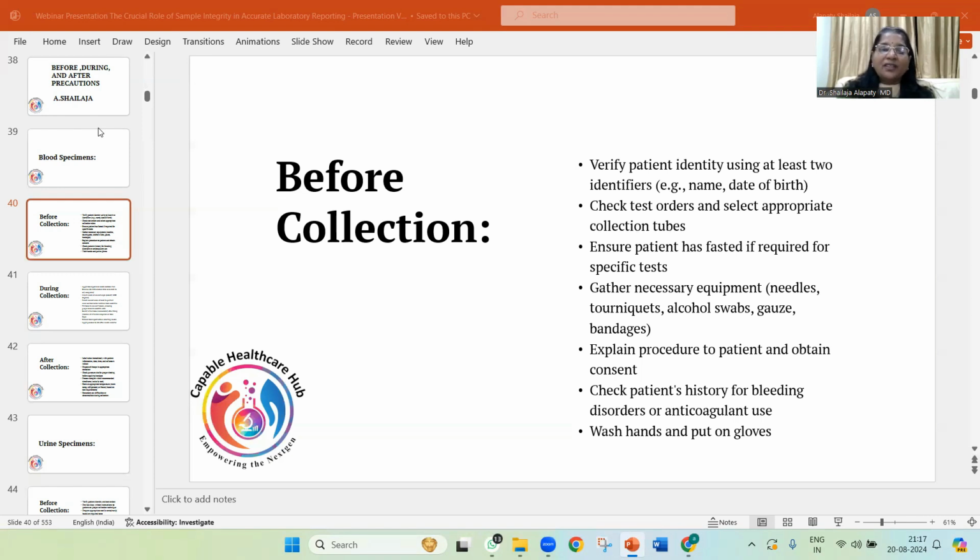Critical values. Okay, Suresh. Right. Ma'am, how to read EQAS? Yes, that's in the QC module. Numbering of samples. Troubleshooting of IQC. Yeah, that's all there in the QC module. When I take up QC, I will tell you critical alert.